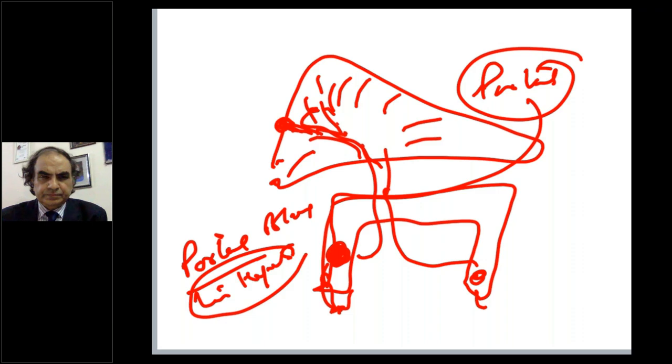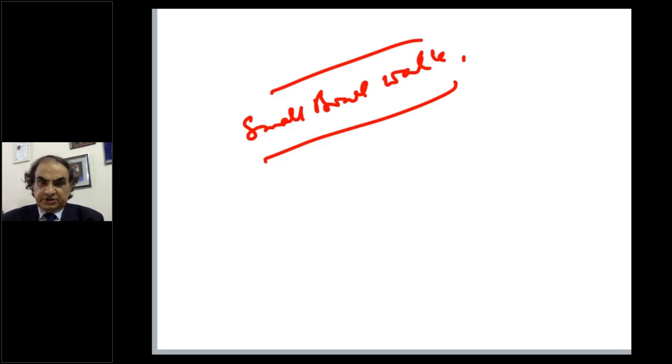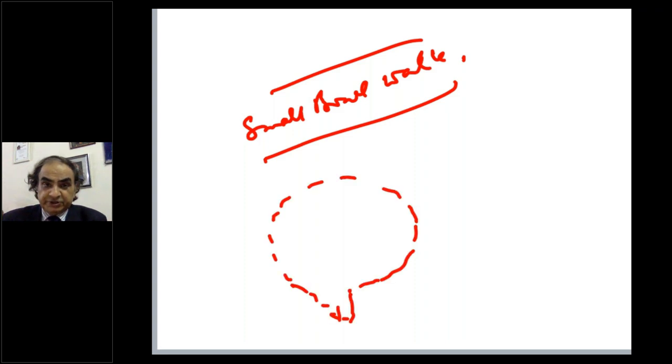Sir, Dr. Shantanu asking the role of laparoscopy or sequence of checking organs in cases of CUP. That's a very good question. That's where it's indicated. Now, it'll depend where the metastasis is. I forgot to mention the small bowel walk at the end. But I wanted to give more time for discussion, and since you've asked, I'll follow the same clock. And then the pelvis and pouch of Douglas for deposits, Blumer's shelf for Krukenbergs, everything I'll see in this process.